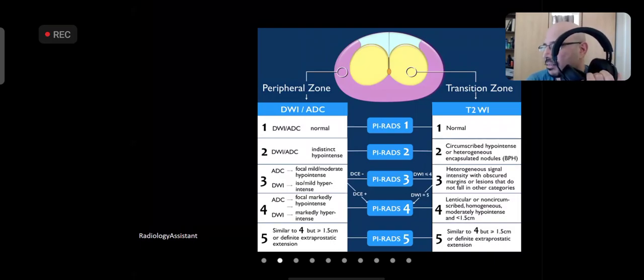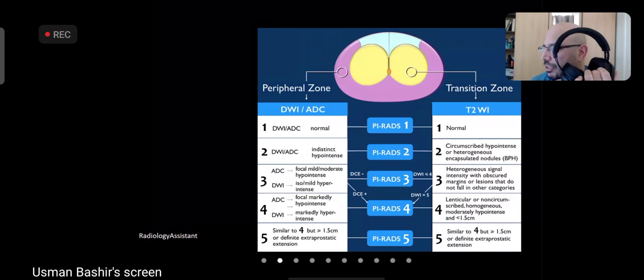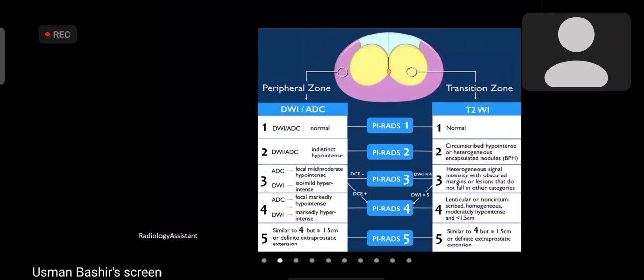But if not, then even in England some doctors still use T2 weighted imaging axial instead of diffusion weighted imaging. But what I'm going to teach is being used. Very good. Very happy to hear that. I'm a big fan of diffusion weighted imaging. Liver में भी हो रही है diffusion. The liver में तो नहीं देखी लेकिन सर breast और इसमें हो रही है prostate.